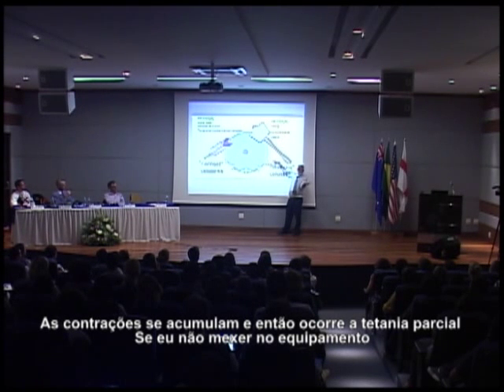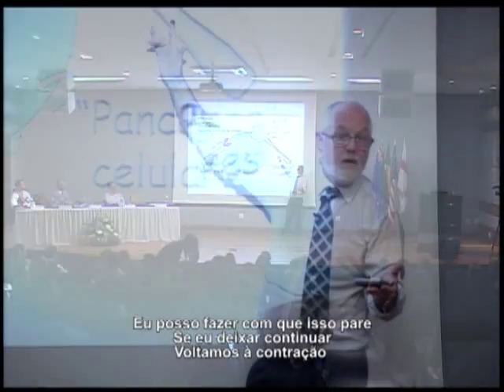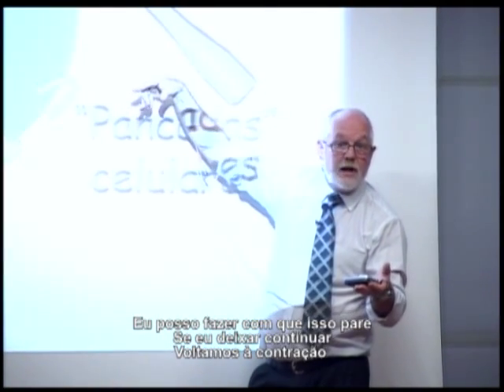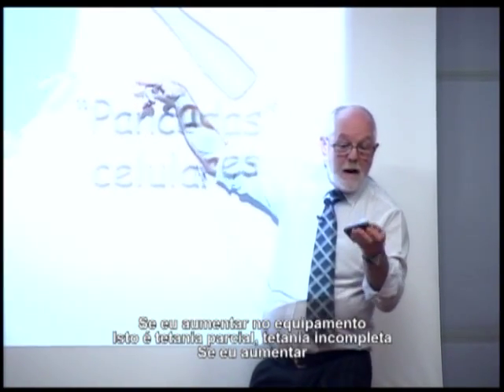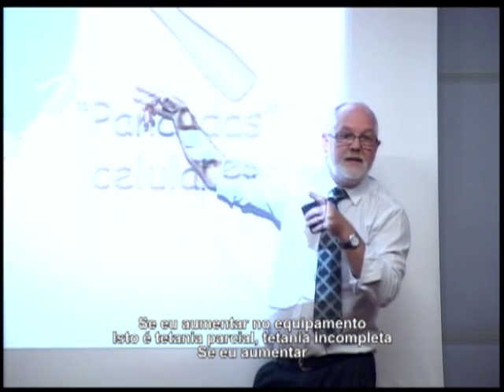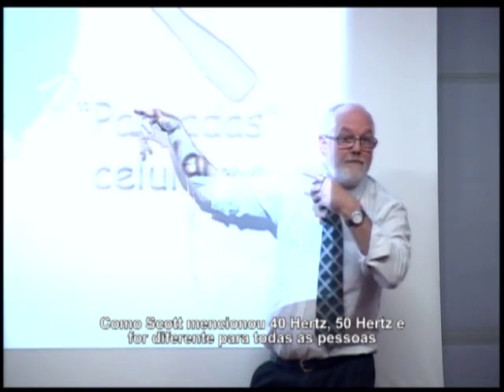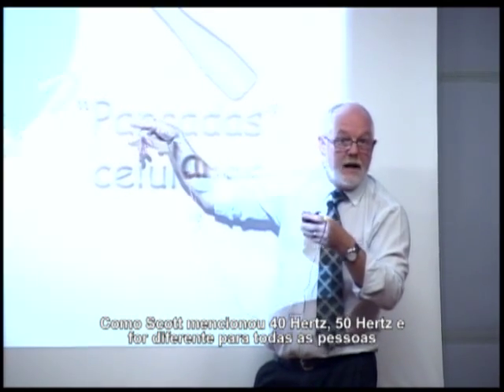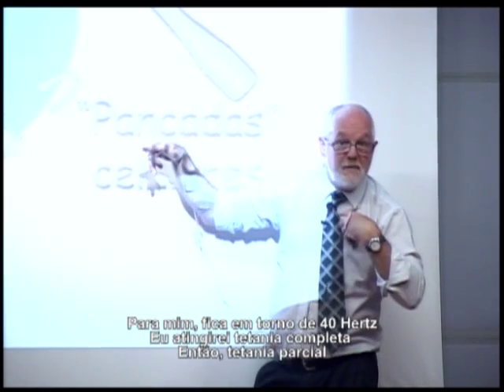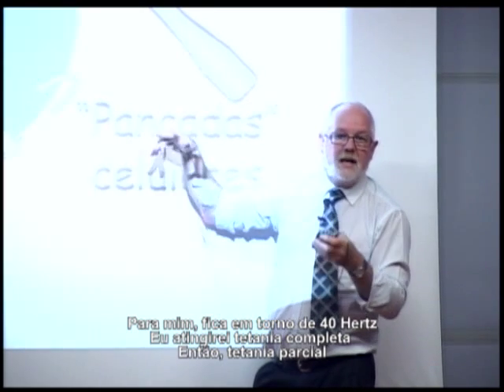All right? So if I don't touch the machine, I can, oh, a bit too strong. If I don't touch the machine, I can stop that from happening. If I let go, I go back to a contraction. All right? If I turn the machine up higher, that's partial tetany, incomplete tetany. If I go higher, and Scott was talking 40 hertz, 50 hertz, and it's different for everybody. For me, it's round about 40 hertz. I will go to a full tetany.